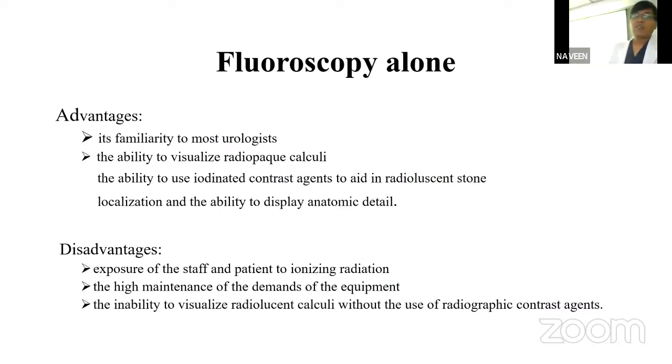So the advantage of fluoroscopy is it can visualize radio-opaque calculi. And the second advantage is it is very familiar to most of the urologists. But the major disadvantage of this technology is the radiation exposure to the staff and the urologist itself. It needs very high maintenance, and it poorly localizes radiolucent stones.